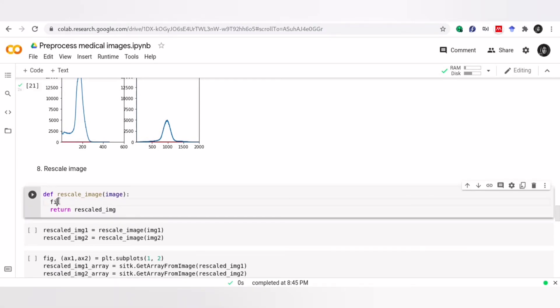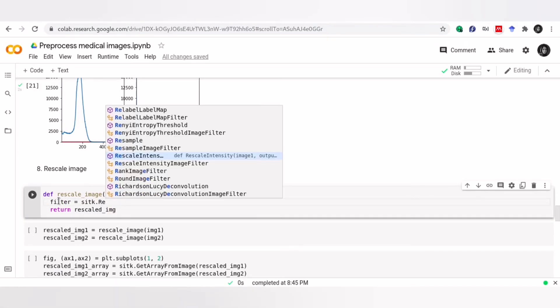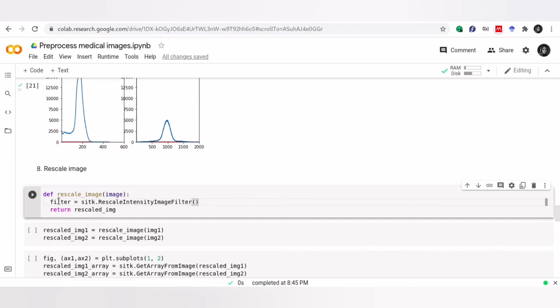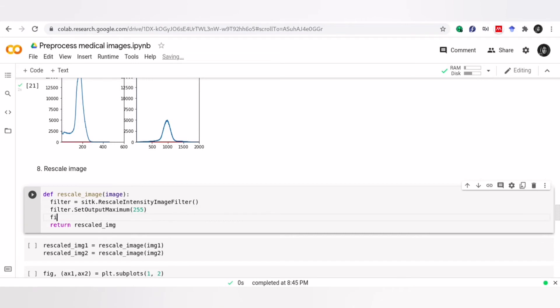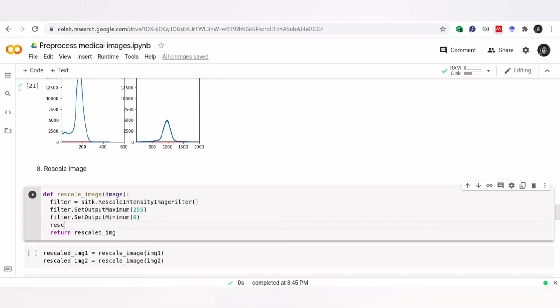I use SimpleITK library to rescale images. To do that, first, I create a filter called RescaleIntensityImageFilter. This filter applies a pixel-wise linear transformation to the intensity values of input image pixels. Also, we have to define the minimum and maximum values that the output image should have.